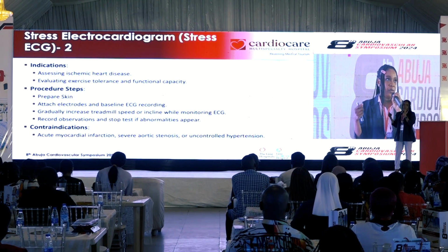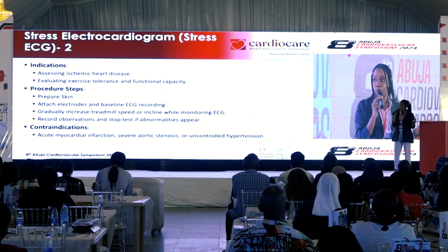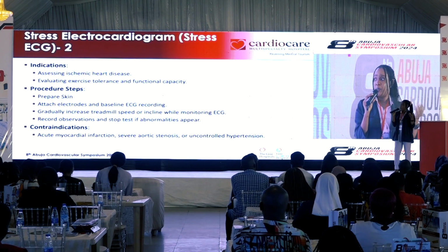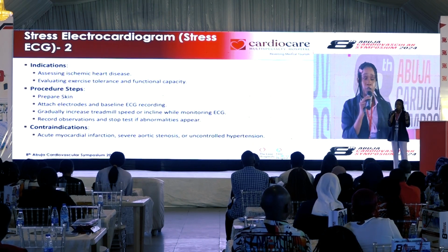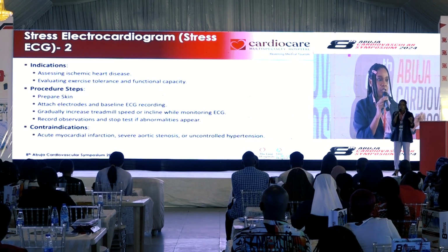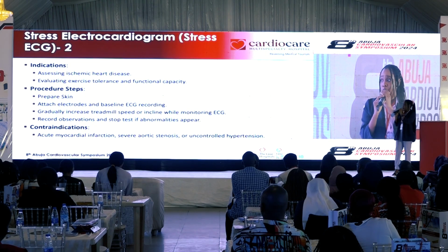So that's why it's also important that you check the patients and ask them about their exercise tolerance level. It will help you in picking the type of modification you want to use for them, either the modified Bruce, the Bruce, or even Naughton. For people of older age, from 60, we try to use a lower one, so the inclination is quite slower than the normal one.